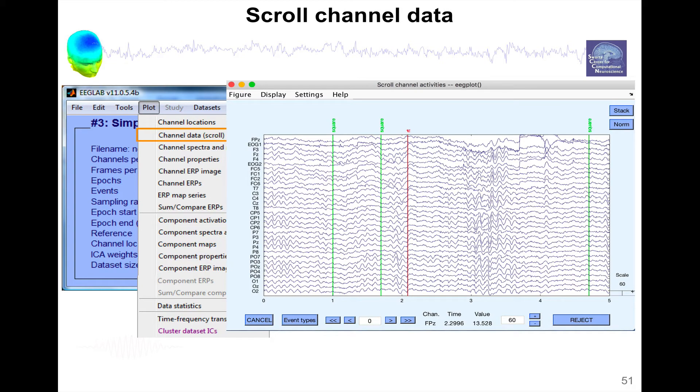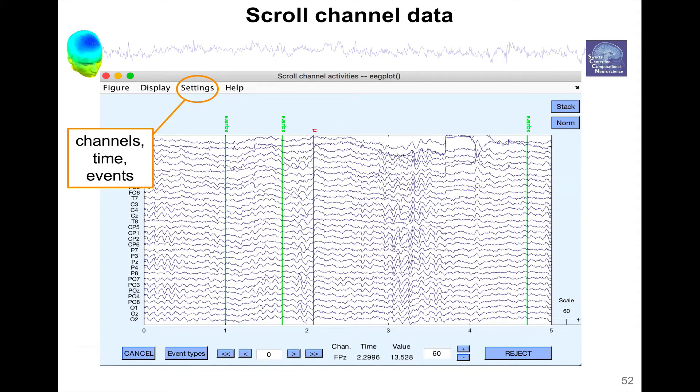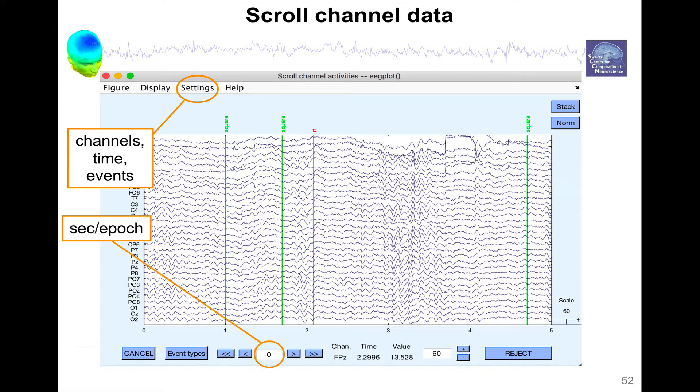We're going to look a little bit at this screen. So first, you have settings, this is where you set the times, the number of channels you want to see, whether you want to display events or not.